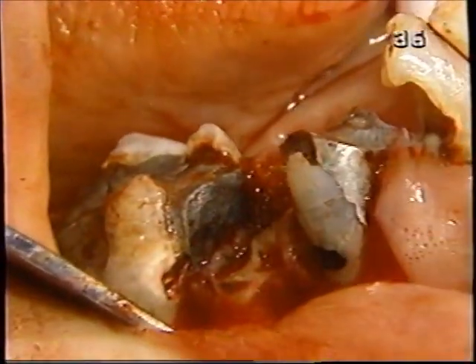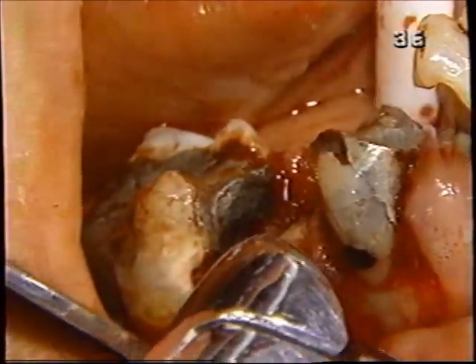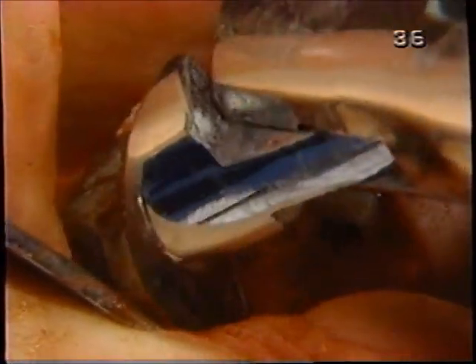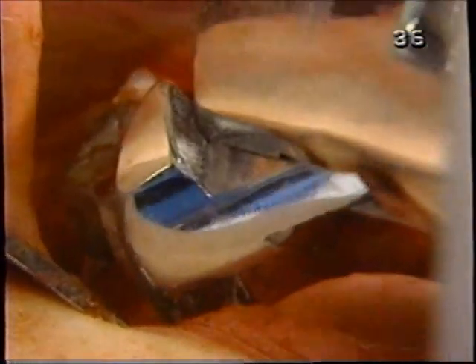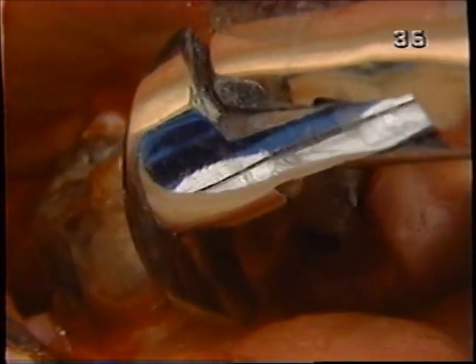We've reflected the lingual tissue and the facial tissue. We're going to put the lingual beak right on the tooth, maybe right at the bone level. On the buccal side, however, we're going to place the beak actually a couple millimeters over bone to get a good engagement of that root. And we'll see what happens with this. Using some rotation, it wants to slip off mainly because of the way it fractured on the lingual aspect.